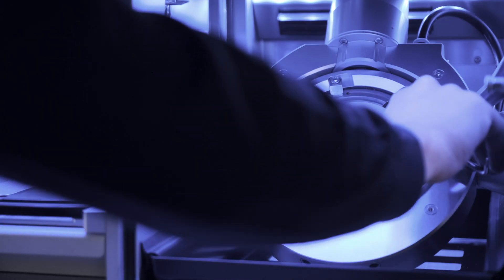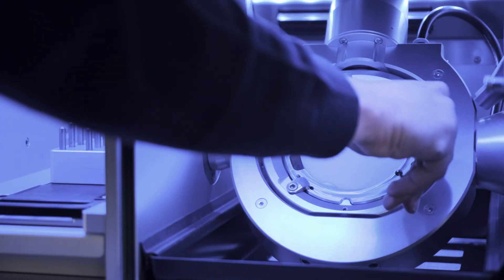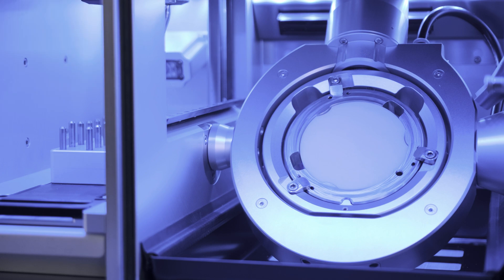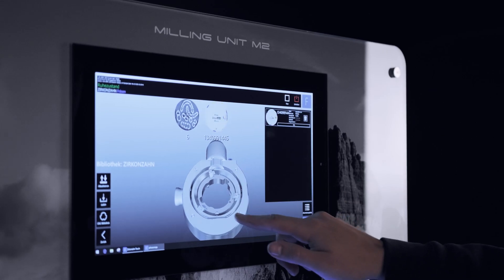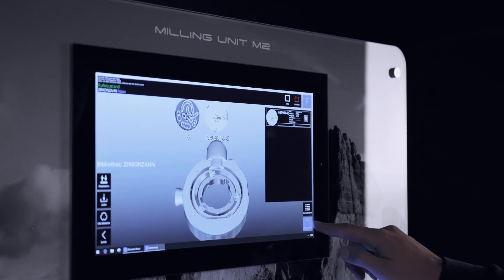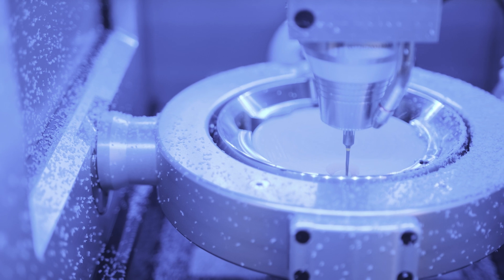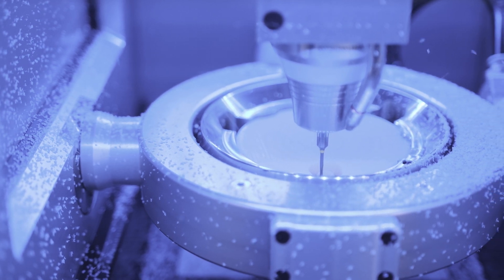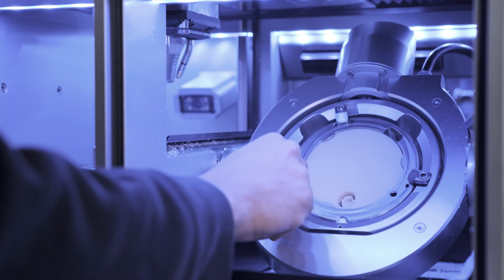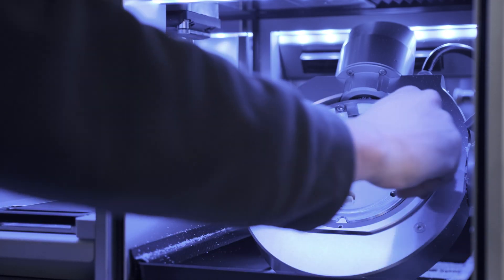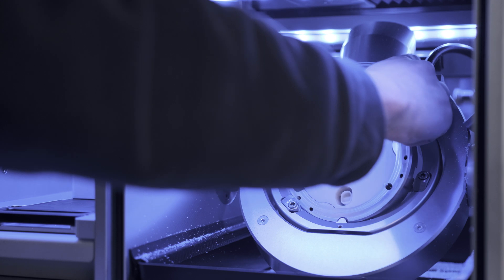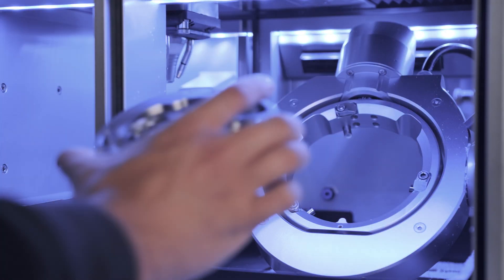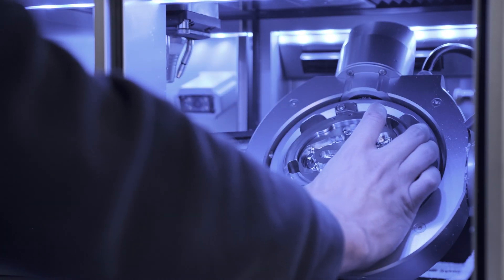Insert in the orbit another blank holder with the blank needed for the new restoration. Once the milling process is finished, the blank with the partially milled job can be reinserted into the orbit with micron range precision in order to continue the interrupted milling process.